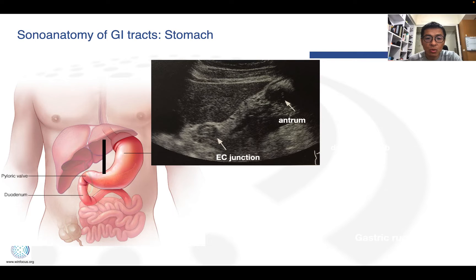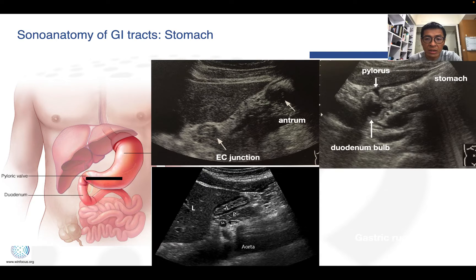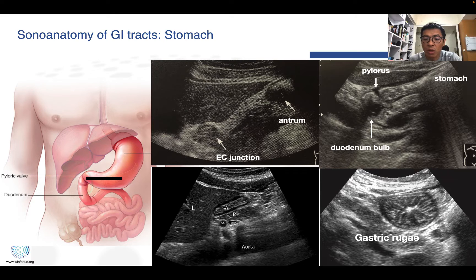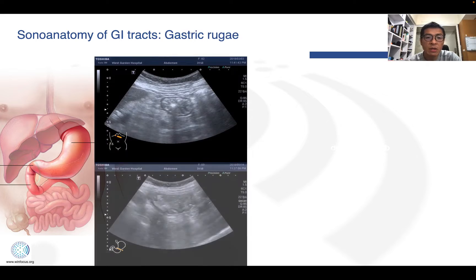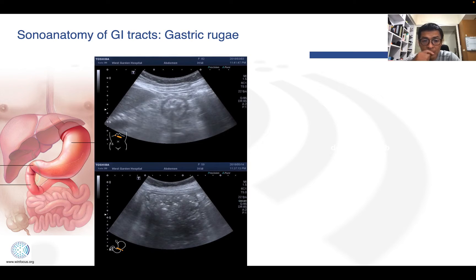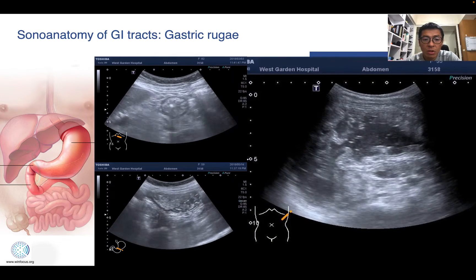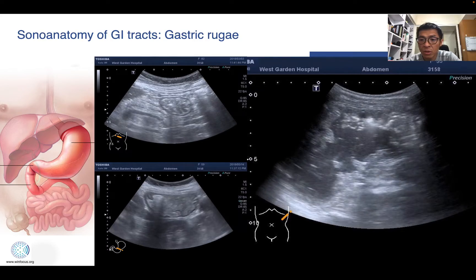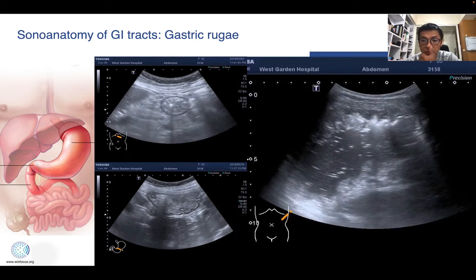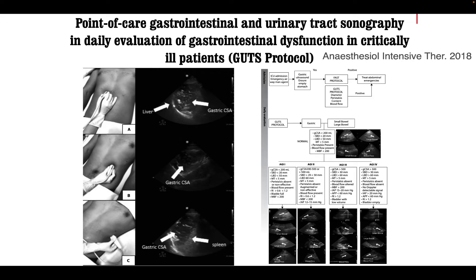Move the transducer downward a little bit. We can see the antrum rotated. It is also possible to see the antrum, pylorus, and the duodenal bulb and second portion. It is also possible to observe typical gastric rugae, especially when there is nothing inside the stomach. When the stomach is distended by fluid, it is also possible to observe detailed information of the GI more. Some protocols incorporate gastric evaluation in daily care for critically ill patients.